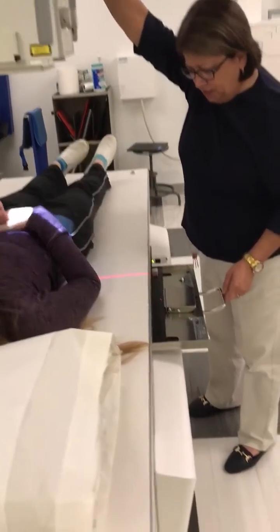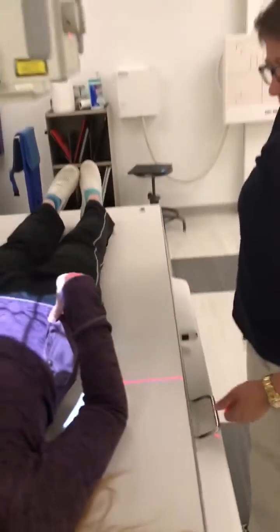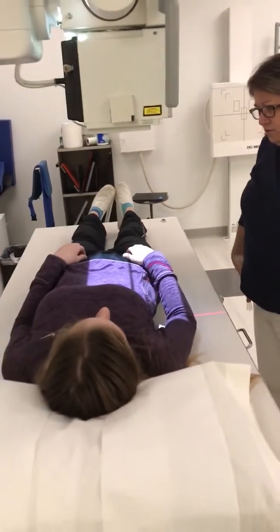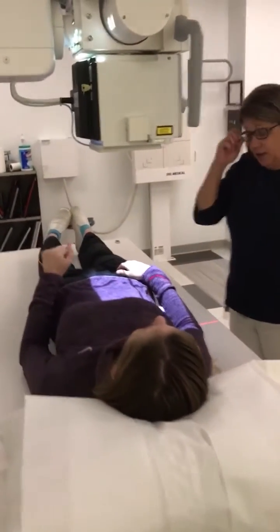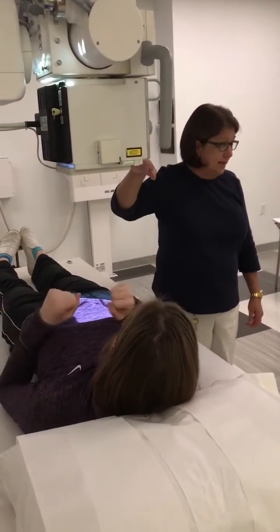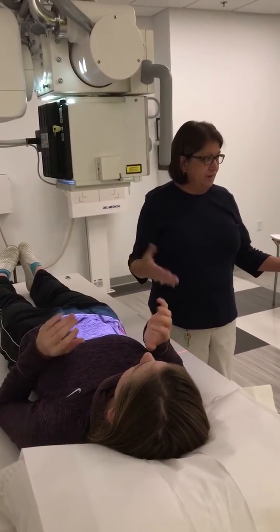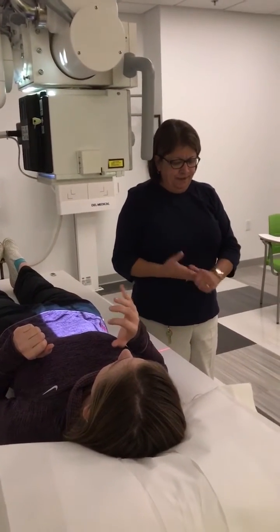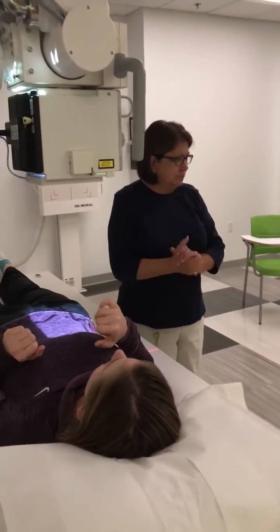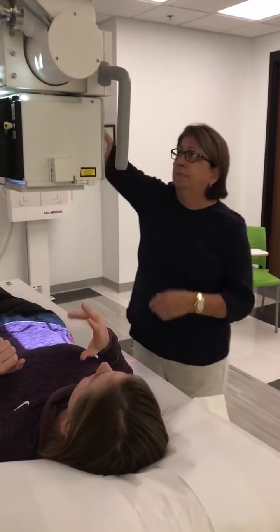Aligning my tube and bucky, my central ray, and my IR. Closing the bucky firmly. This is interesting with the 14 by 17, even though the SID is not at 40, you get the automatic collimation. We didn't when we used the 10 by 12, so be aware of that.